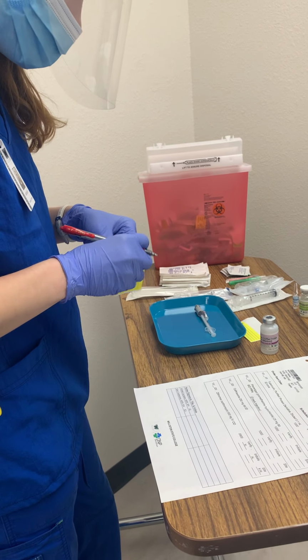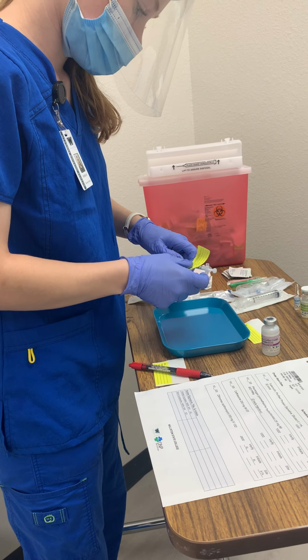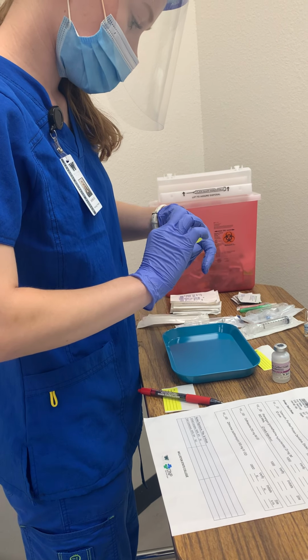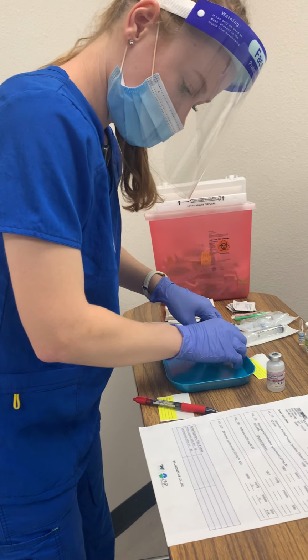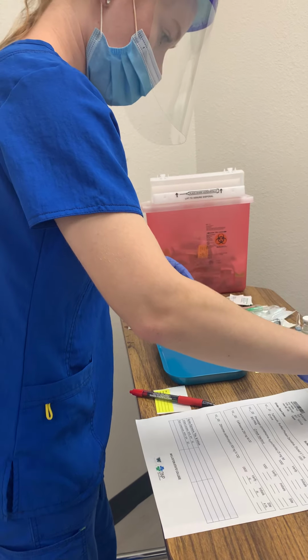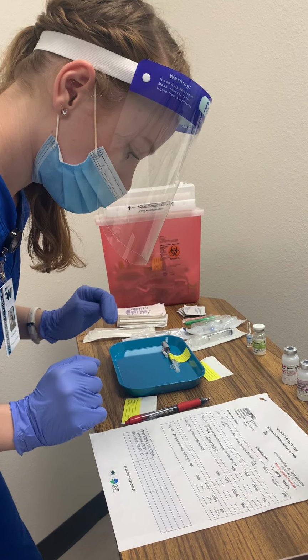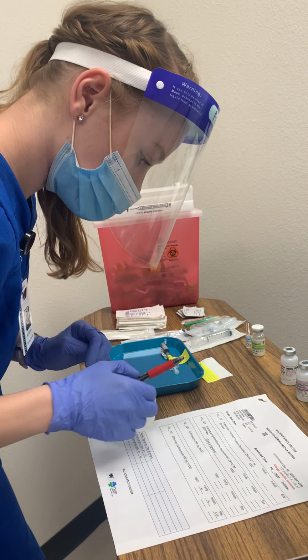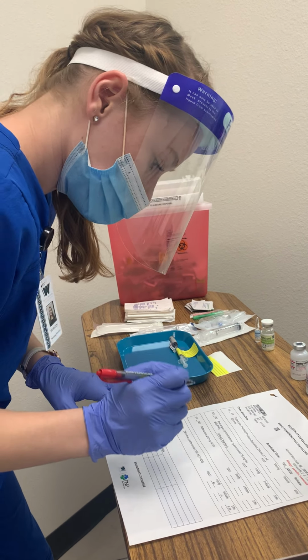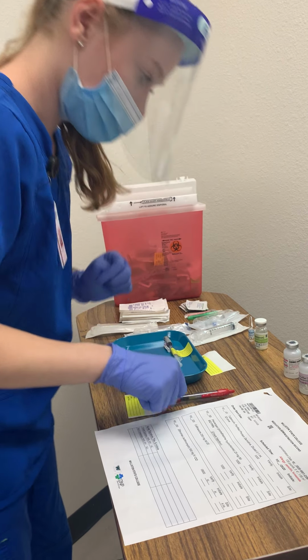So I'll put this on. Okay, that is good, and I checked my expiration date is good, so that is good to go. Since I did my tuberculin, I'm just going to put a little dot there just so I remember.